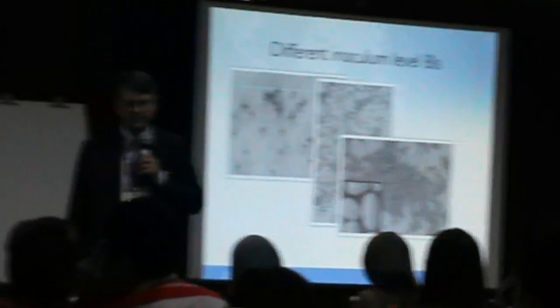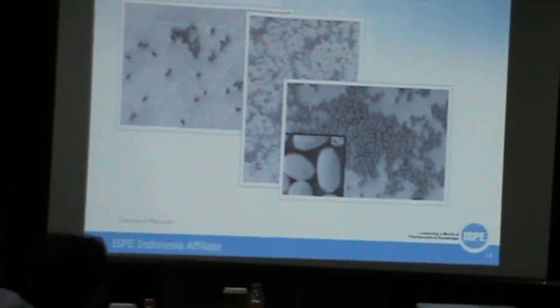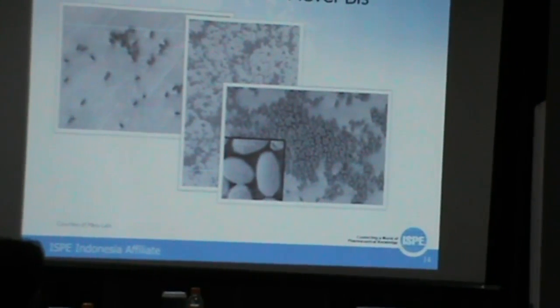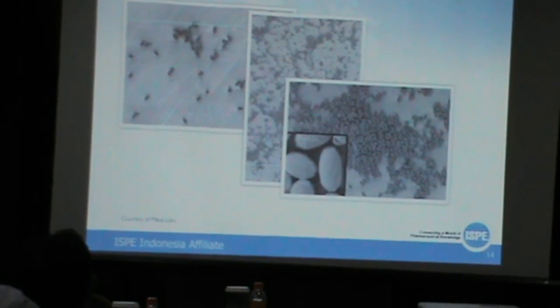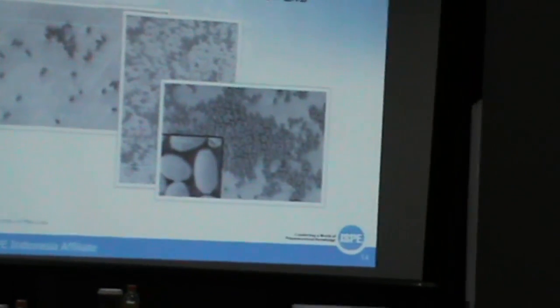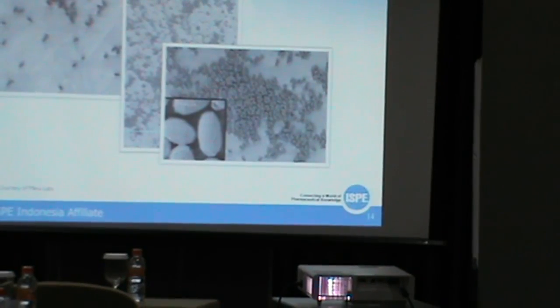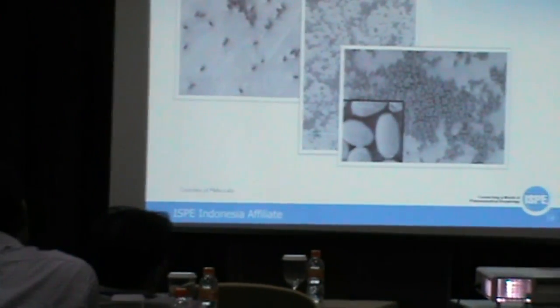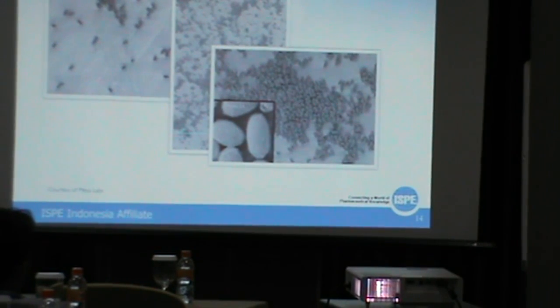Anyway, question to you. These are 3 different inoculations of spores from 3 different manufacturers. For sure, 2 of them will give us some problem of growth because the spores are not very well spread.